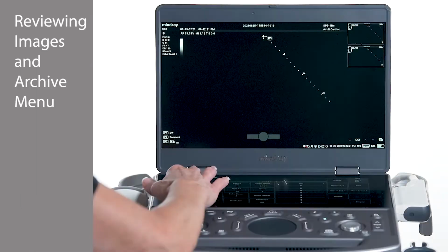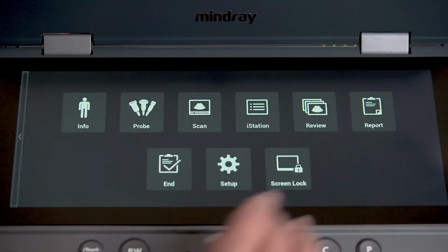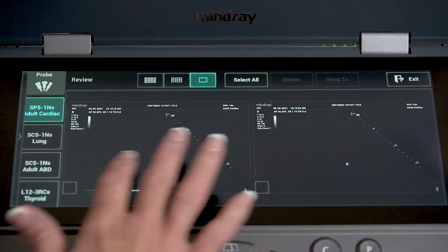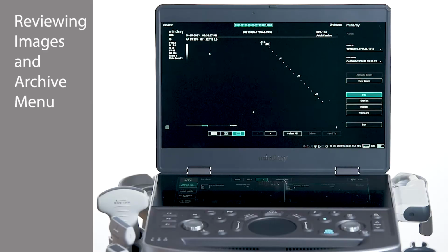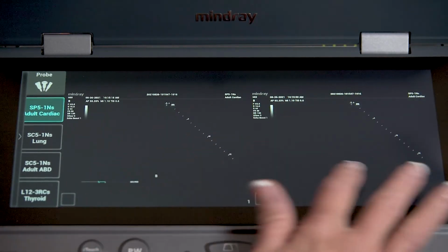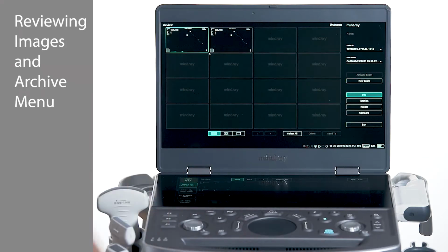Once all desired images have been acquired, tap or swipe over to the main menu screen on the touch panel to review. Swipe a finger from right to left across the touch panel to scroll through images and clips taken. Images may be selected individually for full screen review by double tapping the desired image. To change the number of images viewed from the main screen, select the Grid View button.